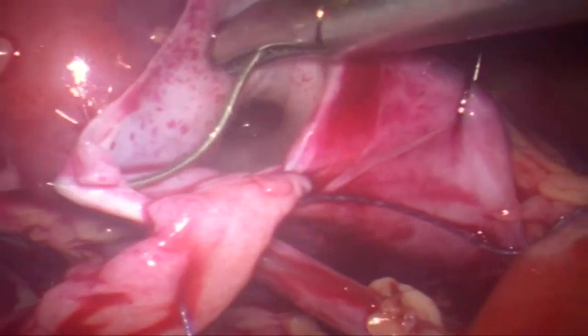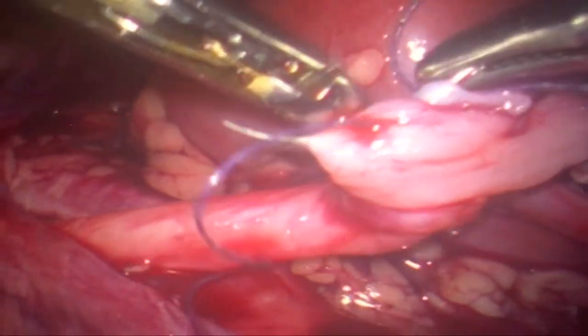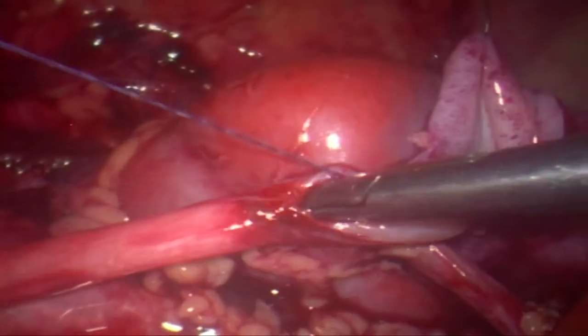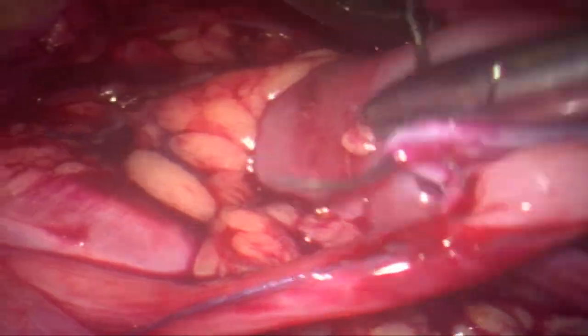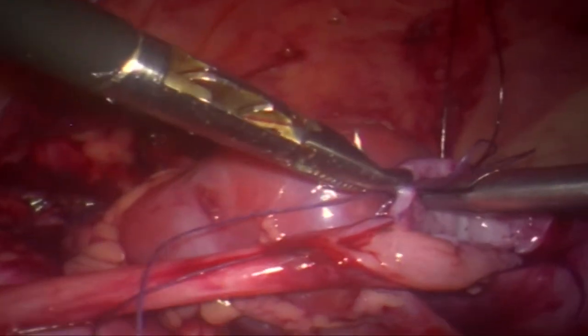The first layer is being run under vision — that is the posterior layer. Once that is completed, before tying the knot, we are going to insert the JJ stent.